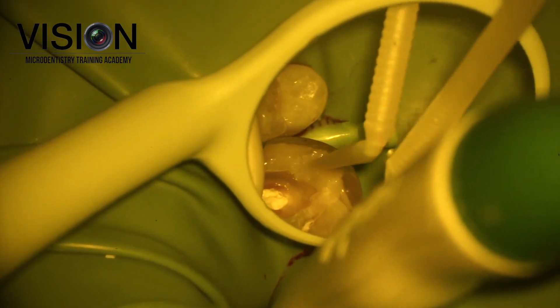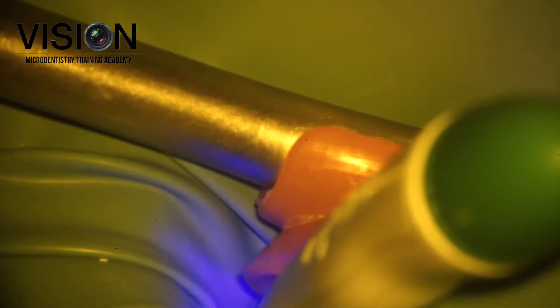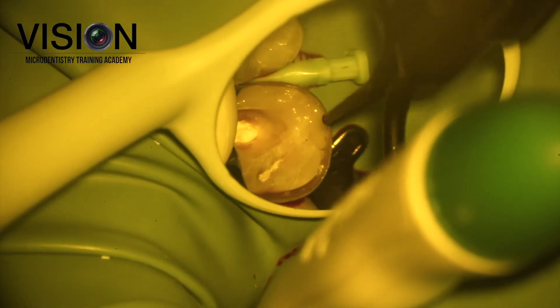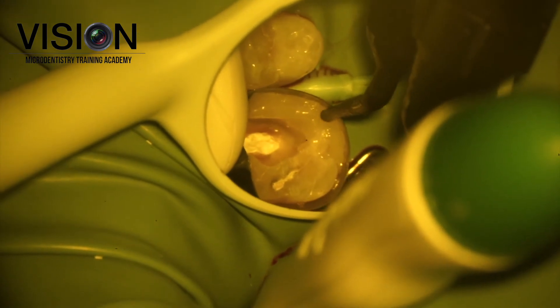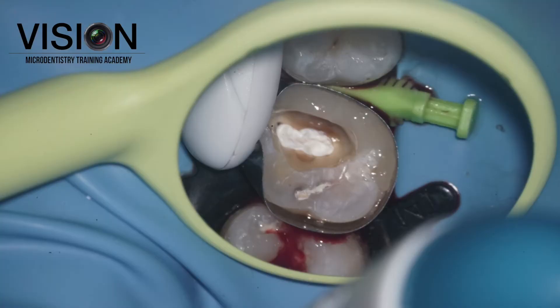Once we are done with the entire buildup, we will remove that small bit of Teflon that you can see, which is basically placed to cover the pulp chamber. Once I have gained access, I usually plug this with Teflon and then do the pre-endodontic buildup, patch up all these small areas with a flowable composite, followed by light curing. Once the material is set and cured, we will remove the matrix band and continue with our endodontic procedure.